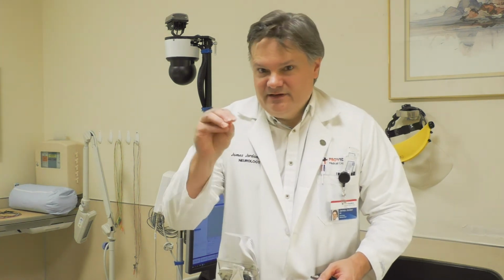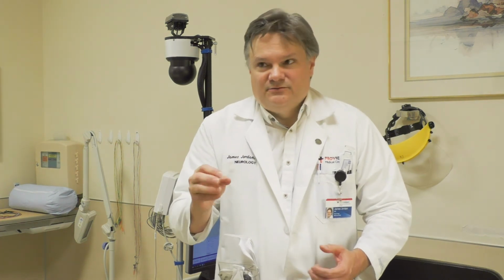Now, I wasn't actually having a seizure, obviously, but if you're actually seeing a seizure, you'll want to detail every evolutionary step of the seizure as well. Right arm is now twitching, right leg is now twitching, the patient is turning their head to the right, something like this.